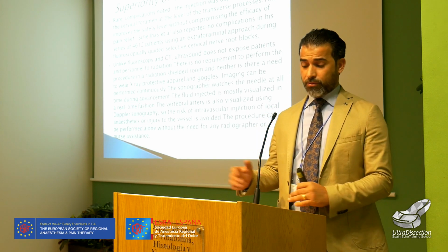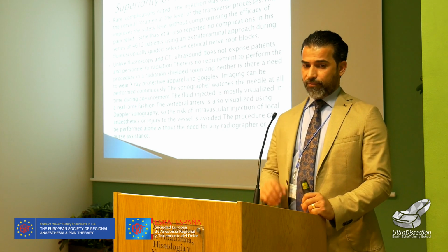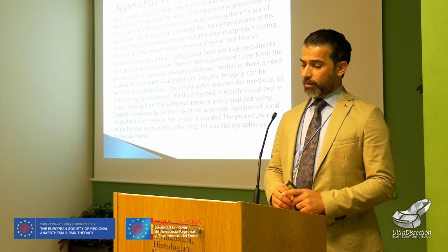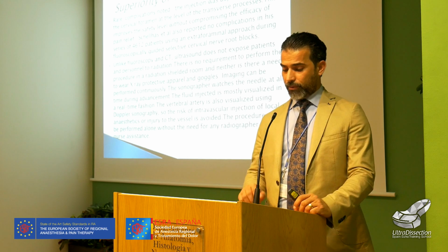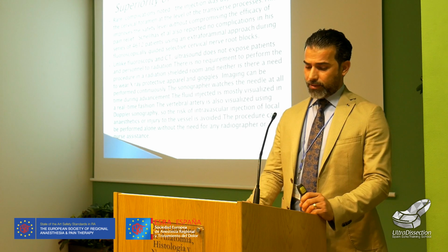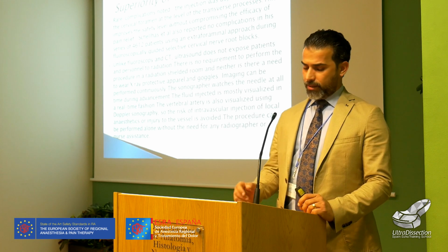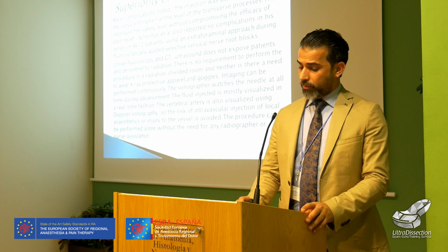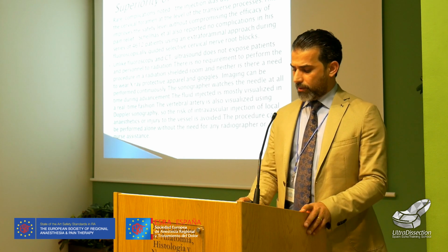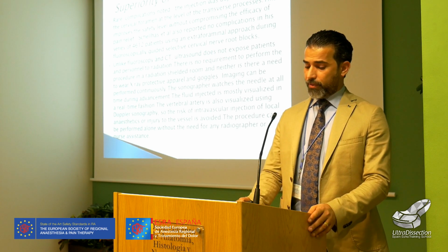But by ultrasound, as we will also see in videos, you find after these slides it is very easy to detect the extraforaminal space and the nerve, and then to inject around it or to hydrodissect, depending on the pathology. Unlike fluoroscopy or CT scan, ultrasound does not expose the patient, as Dr. Bar said, to radiation. There is no requirement for a radiation-shielded room, and neither do you need to wear a lead apron or goggles.